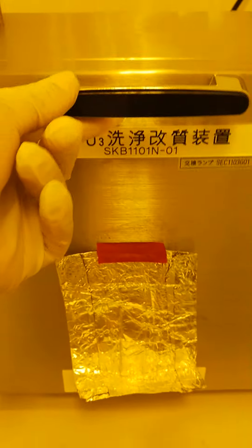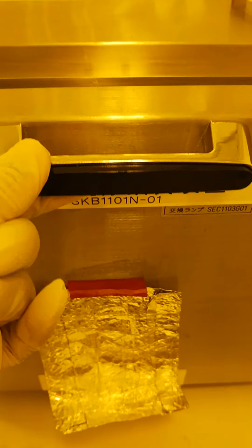Now we open the ozone machine door — this is the door, just keep it aside. And this is the sample holder — open it like this. You can see the rectangle line in the middle of this board or sample holder. You can just put the sample here like this.